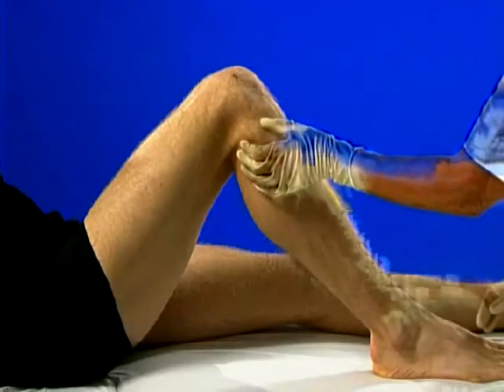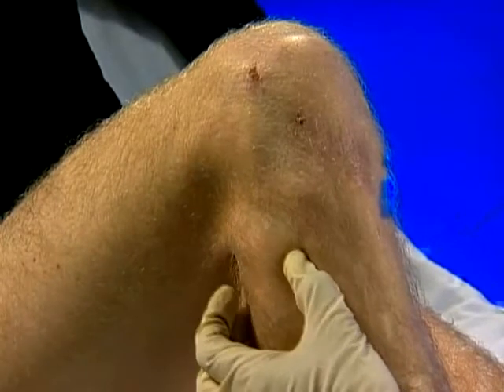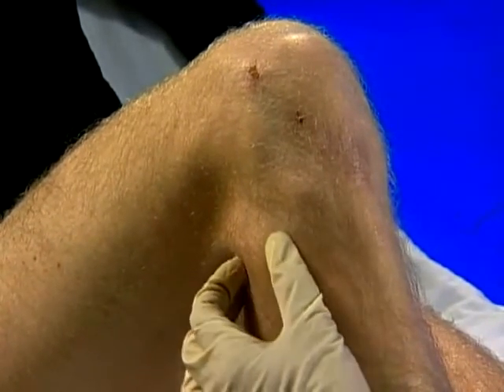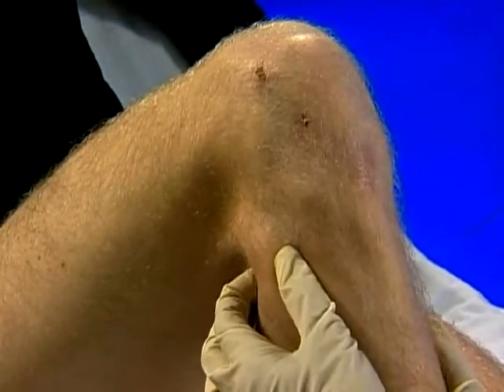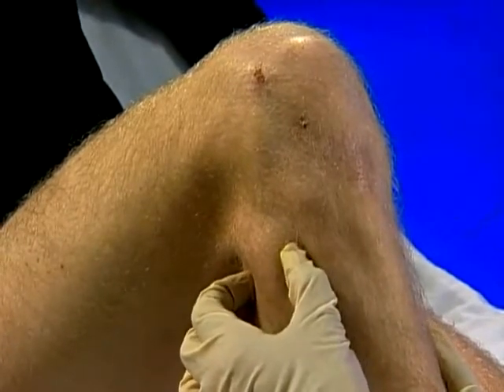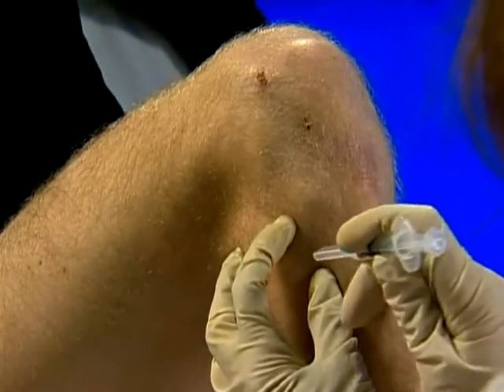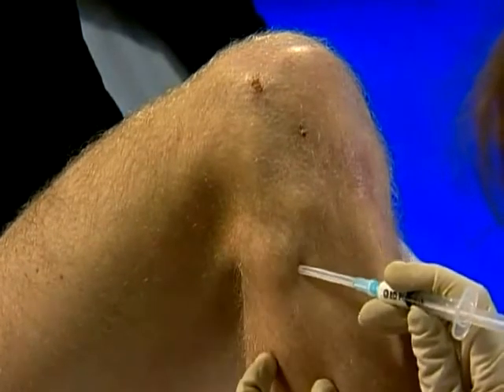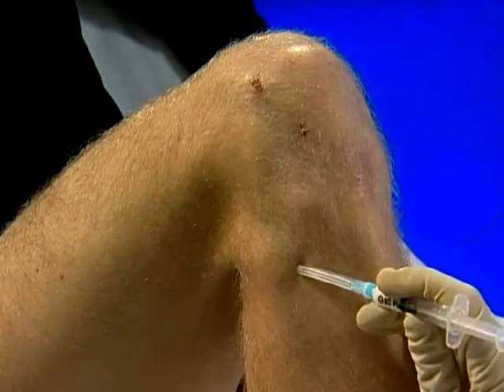The joint line runs at an oblique angle and the entry point lies on the anterior aspect. Please note, we never inject in the presence of an open wound. Find the joint line by gliding the fibula on the tibia. Mark the entry point here, clean and firmly stretch the skin, and rapidly insert the needle perpendicularly. Angle upwards and laterally to penetrate the joint space. Aspirate and inject as a bolus.